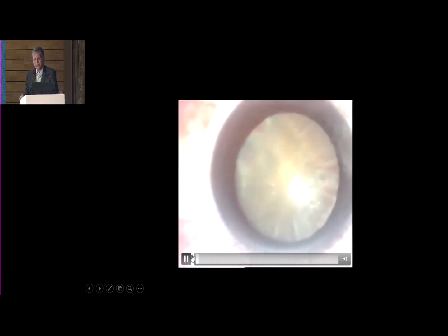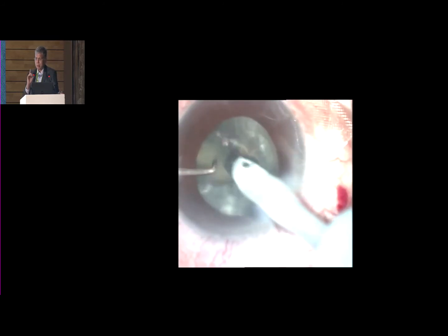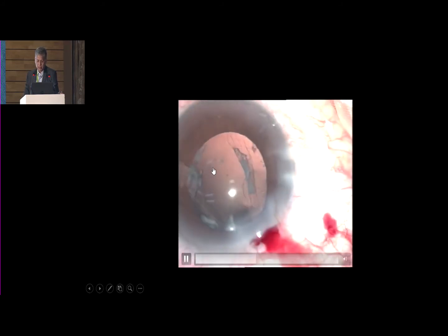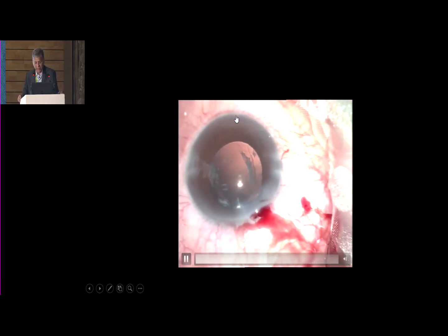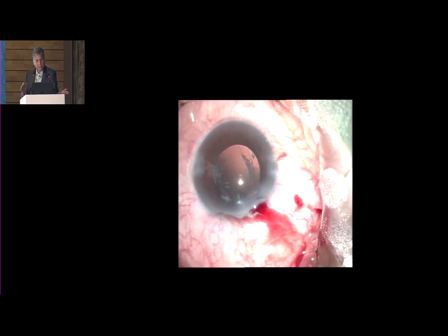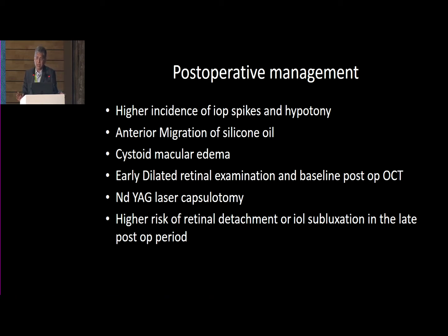This is another case — a mature cataract. Look at these two vertical lines going down. As the phaco progresses, remember that a mature cataract after vitrectomy means there could have been a lens touch. This patient had an ultrasound beforehand confirming the retina was attached. Here you see the capsule is torn because there was a lens touch, and the moment hydrodissection was done it opened up completely. So at the same sitting I decided to remove the nuclear fragments with the cutter itself, and as the vitrectomy progressed, a superior retinal detachment appeared. These surgeries can be extremely unpredictable.